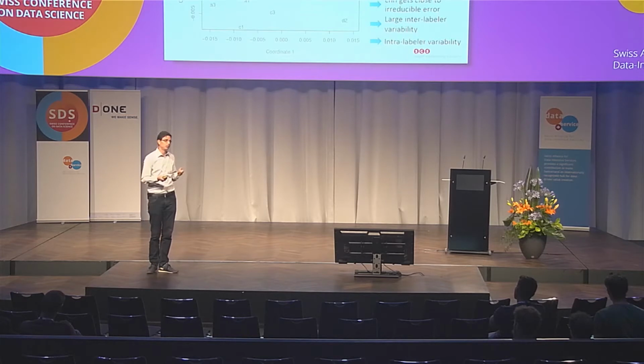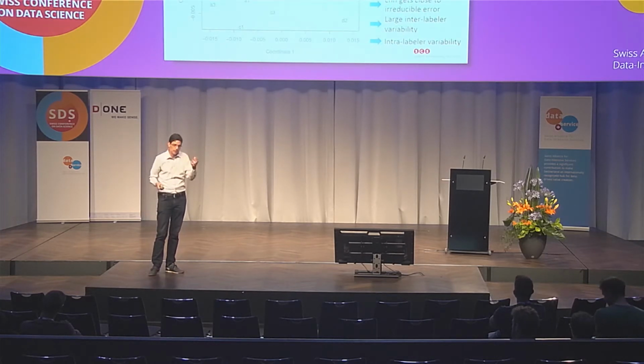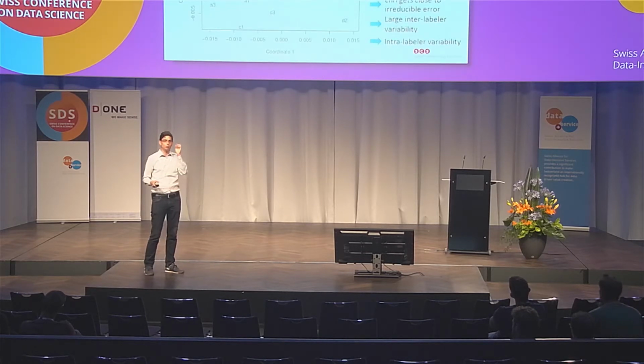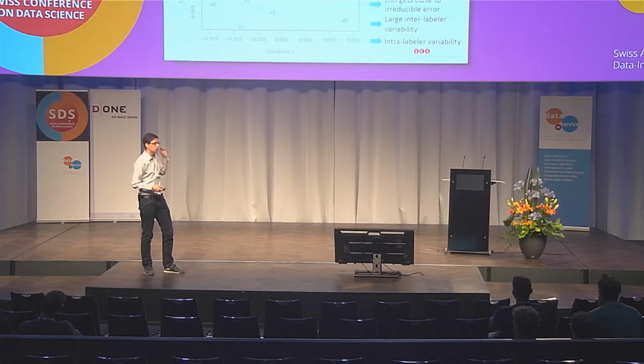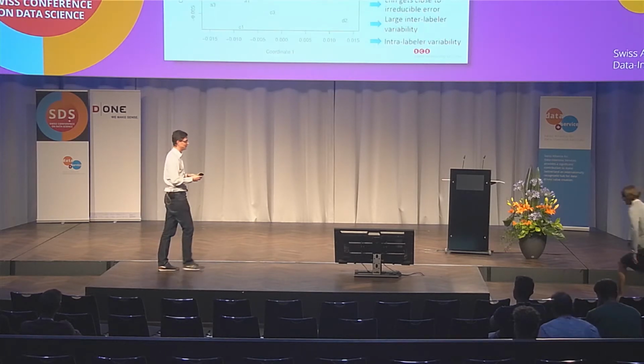I think in medical applications you often have the case where you don't have one golden ground truth that is true, but you have some variability among the possible interpretations of the ground truth, so some different truths. If you train a machine learning algorithm as a data scientist, you have to think from which ground truth you want to learn. Do you want to learn from one doctor only, or do you want to learn from a consensus of other experts? So that concludes the first part, and now let's hear from Susan how we turned that prototype into a productive software.